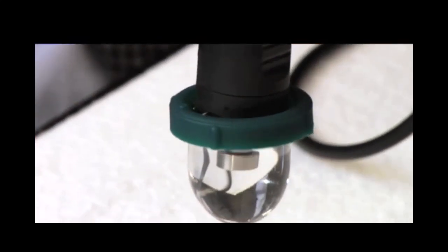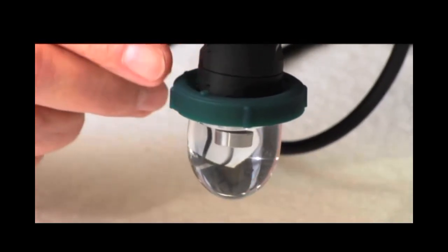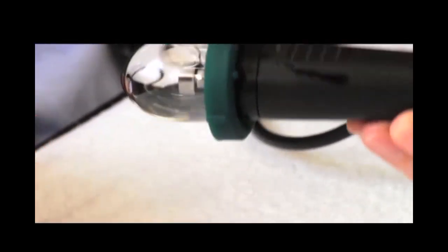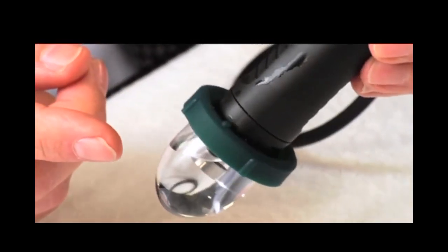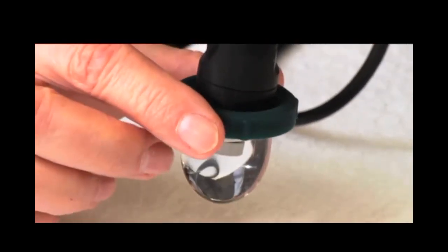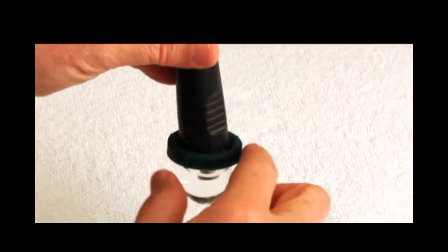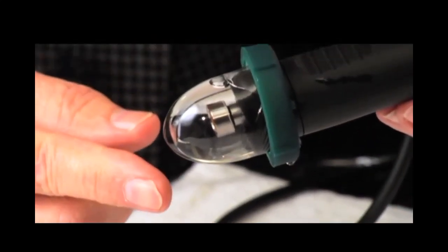A third way to change pressure is by pinching this collar. This collar is more than just a sealing mechanism, but it functions as a valve also. Right now there's an air bubble in here. If I want to lower pressure or get rid of an air bubble, I can just squeeze the side of this. You saw the water escape. You can start to see wrinkles here. I can do this again. And now you can clearly see some wrinkles on the side of here.